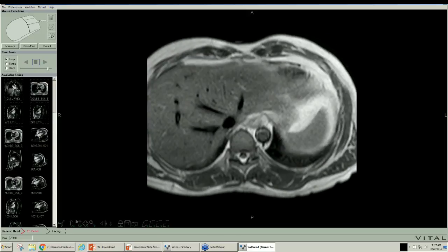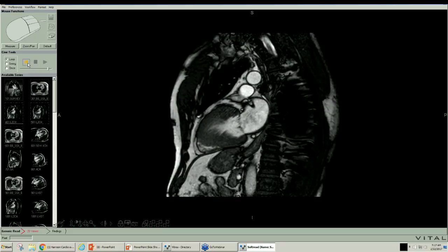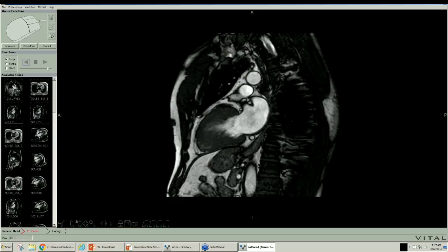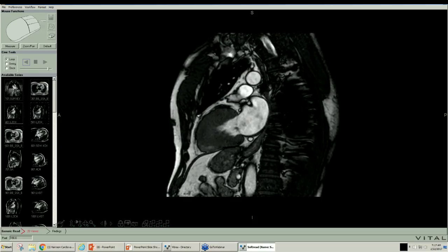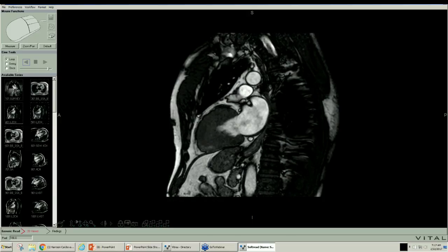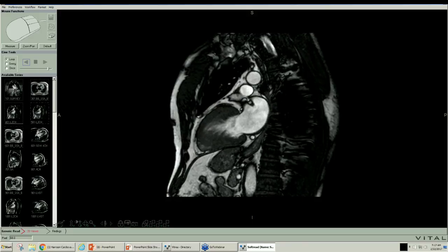So let's take a look at some left ventricular function. This is a markedly hypertrophied left ventricle. It's almost like that spade sign that you see in patients that have the hypertrophied apex or tunnel left ventricle, like the Japanese have reported, the spade sign in left ventricular diastole and systole. And you can certainly say that this is more than just apical hypertrophy. This is all ventricular hypertrophy.